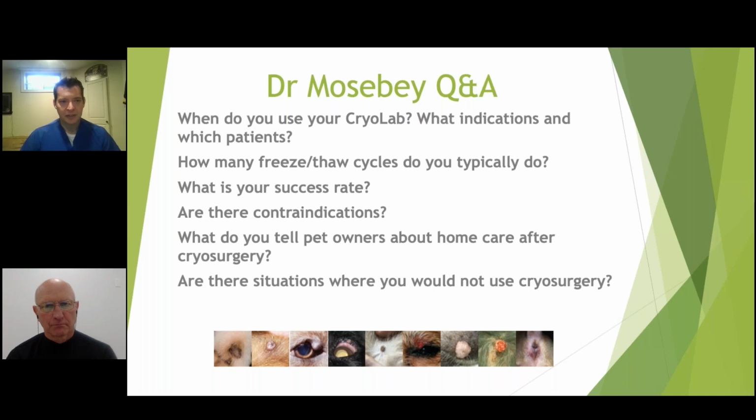Besides that, we're not going to treat subcutaneous lesions, things deep or intradermal, we're not going to treat those. No, that's probably the only thing, that or the extra wiggly patient who's not going to tolerate us freezing around its eyelid and getting a good response. Those are the only times I'll usually say don't use it. But even those patients, I think it's usually worth at least a shot before you give up on it.